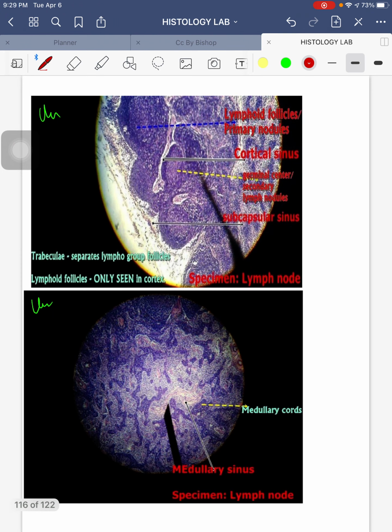Okay, so here, these are the ones taken from the slide. Alright, so again, subcapsular sinus. Sorry if it's repeating again and again. I just want to show you the difference between the actual lab and the textbook. It can really help and supplement your learning, especially if you decide to pursue medicine or other microscopic studies in third year. So you will be acquainted microscopically.